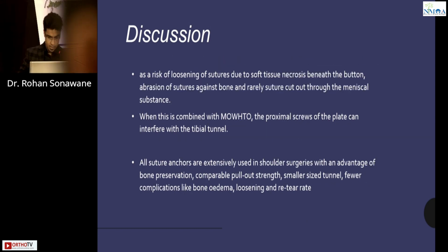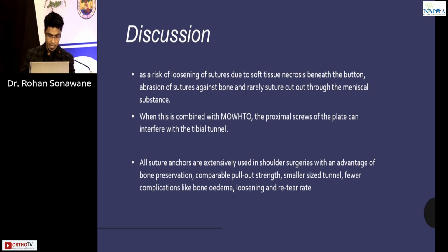All-suture anchors are extensively used in shoulder surgeries with the advantages of bone preservation, comparable pull-out strength, smaller size tunnels, and fewer complications like bone edema, loosening, and re-tear rate.